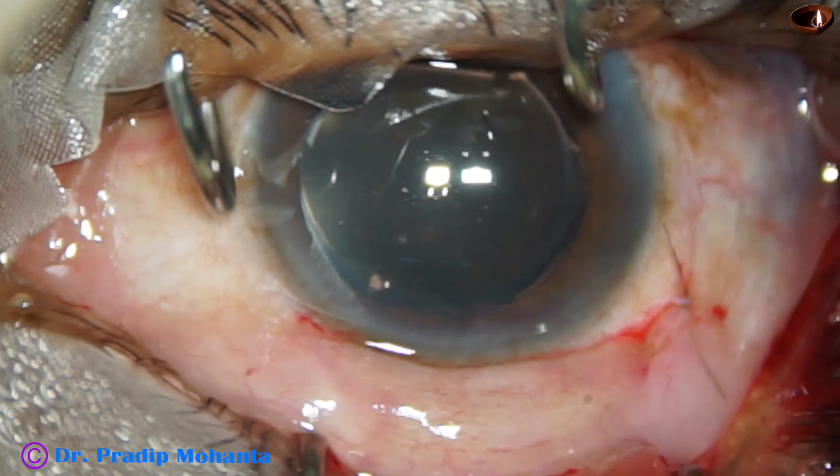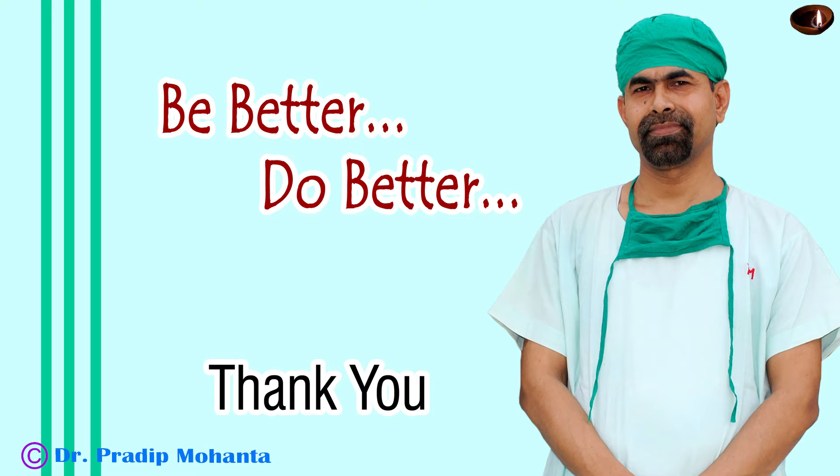Remove the speculum and conclude the case. Thank you very much for your attention. Hope this video will help you in developing your surgical skills. Be a comprehensive cataract surgeon — not only a good phaco surgeon, but a good SICS surgeon also. There are cases where phaco may be dangerous, or where you may have to convert to SICS because the rhexis has run to the periphery and the nucleus is very hard. In those cases, you can convert to SICS if you know the technique. Be a great surgeon and serve your patients with love, respect, empathy, and great surgical competence.